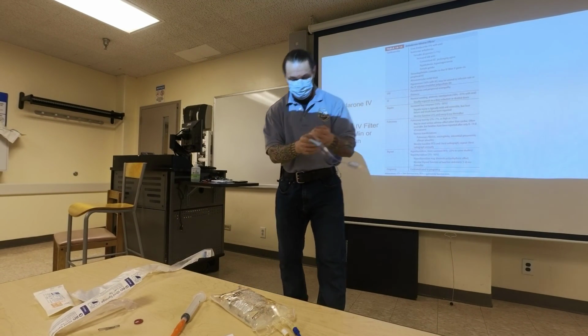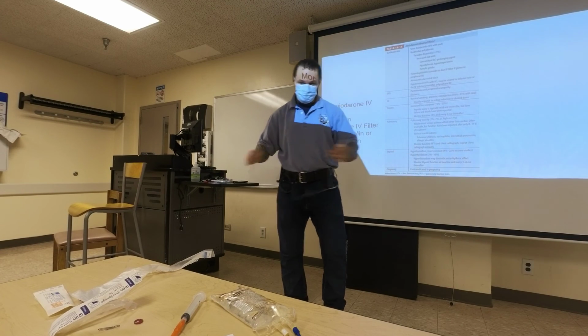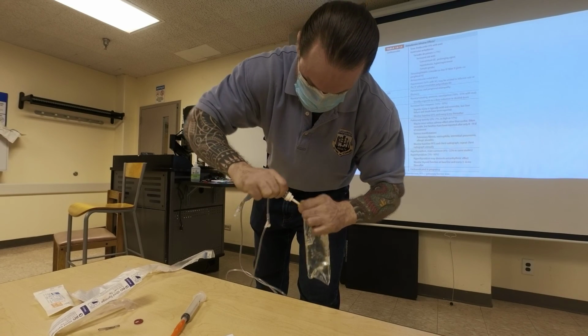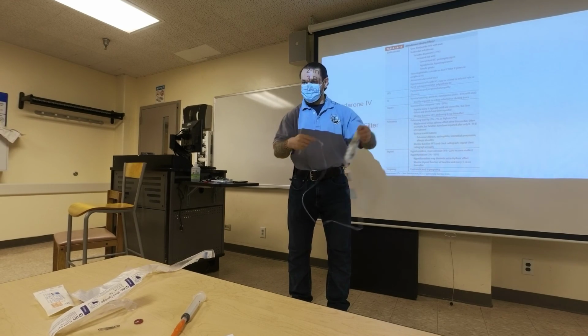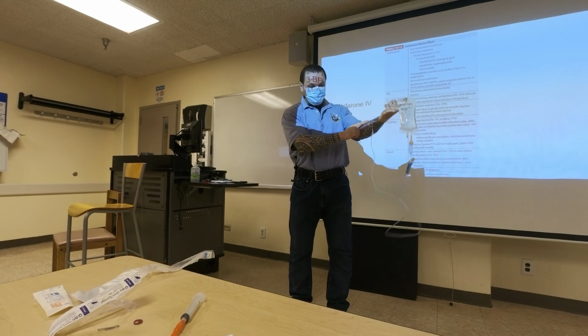This tubing goes like this to your line. Let's say this spikes the bag. Don't ever do this. So we got the amiodarone, right? Let's say we mixed it right, we flushed it, everything's fine, we have IV access. You guys did this. You're infusing it.